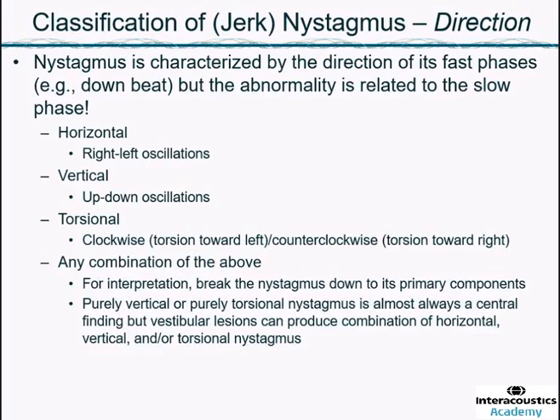Now, when we analyze the nystagmus, we have to interpret each component of the nystagmus on its own and then combined to look at what source it could come from. Generally, break down the nystagmus to its three primary components if you see a combination of these, and then interpret each one separately.